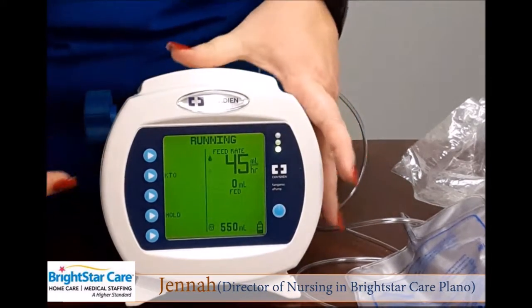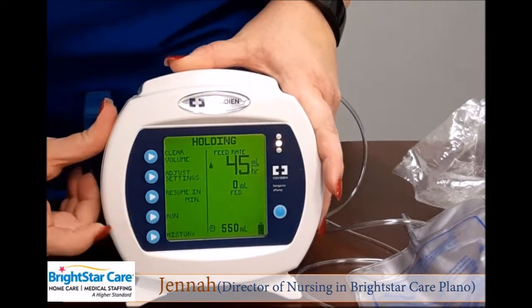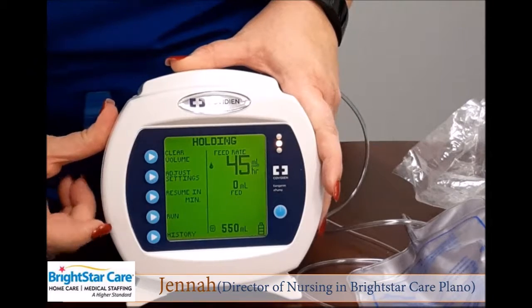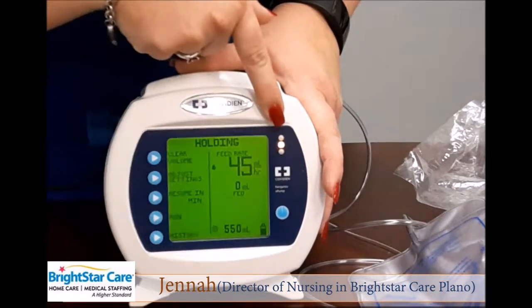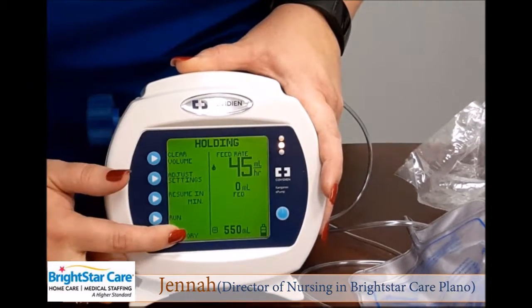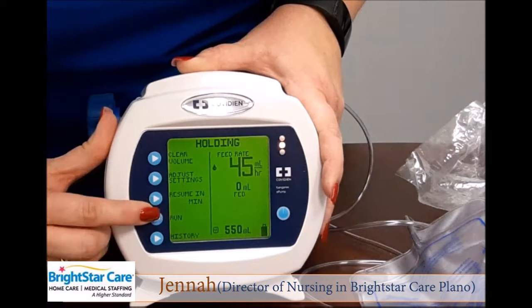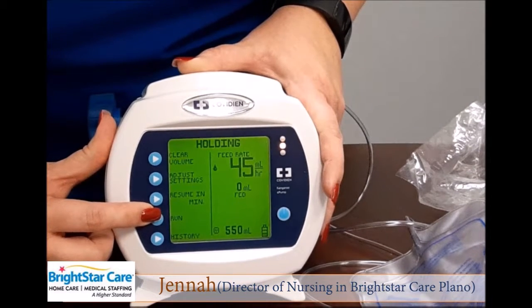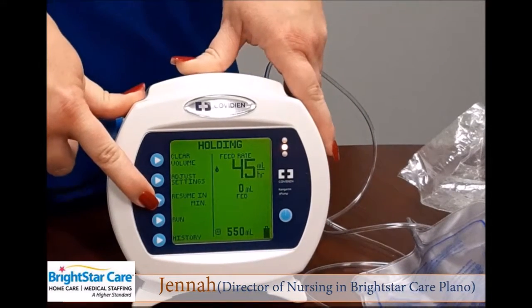If for any reason I need to stop my feed, I'm going to press hold. You notice I now have a message of holding, as well as a drip that is not dripping, and a yellow light rather than green. It gives me a whole new menu where I can go in and readjust my settings, or I can choose to go ahead and run again. And I even have an option of being able to run at a certain time.